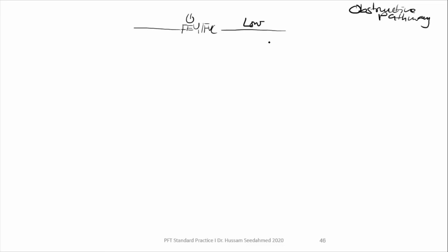إذا قلنا what is the first step in interpreting the PFT? Look at the ratio. If the ratio is low كده أنا ماشي في اتجاه منه الobstructive. الخطوة الجاية قلنا look at the FVC. هنا عندي خيارين إما ال FVC تكون normal or high أو ال FVC تكون low. لو كانت ال FVC normal or high ده بيبقى لي طوالي straight forward this is obstructive lung disease.